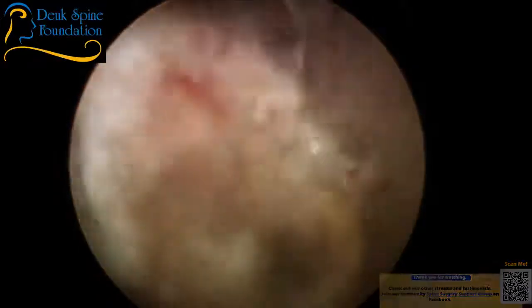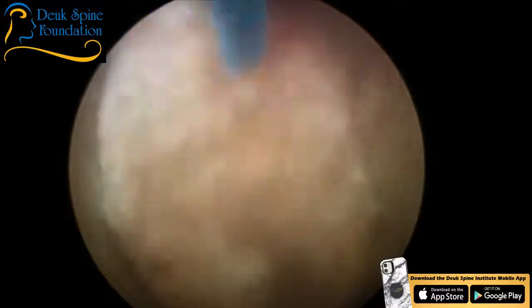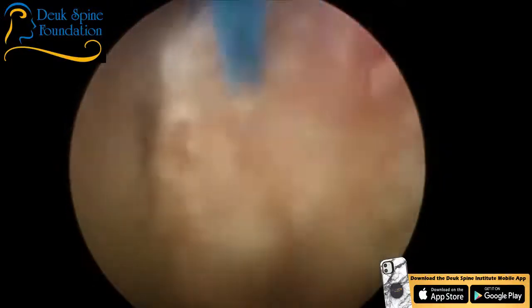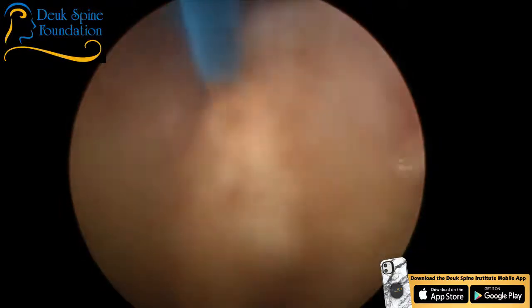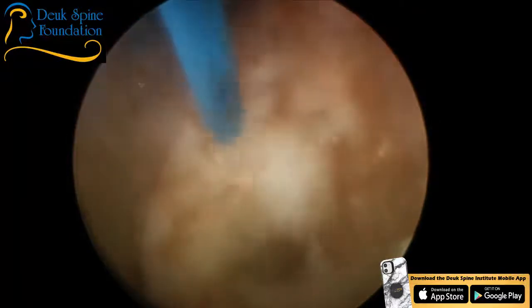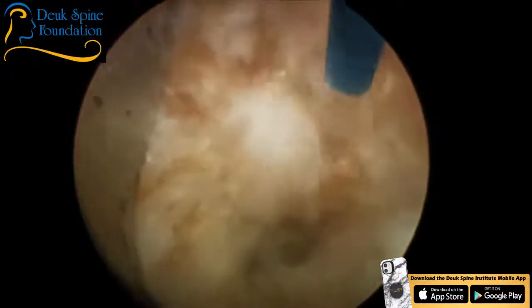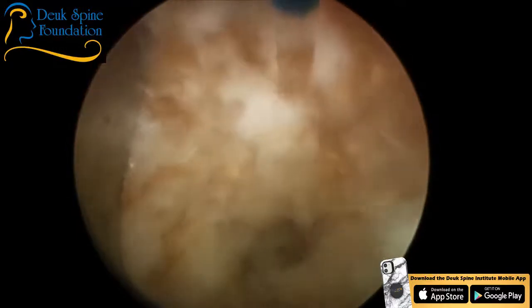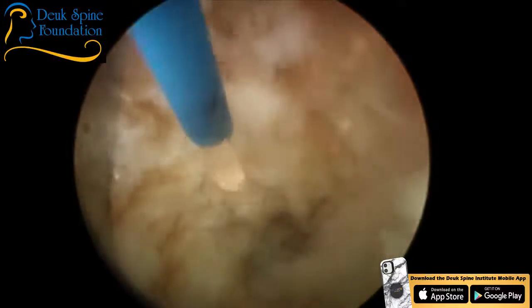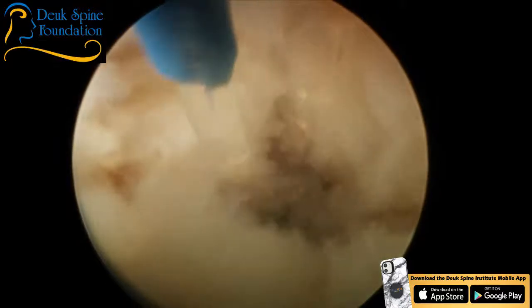All right, that's a little epidural vein bleeding. And we are just about done, probably another minute, and we're done. How's he doing? Good, good, thank you. And then we have another laser surgery coming up next. I think it's a lumbar, right, Louis? Yes, sir, 2 levels. 2-level lumbar. And that patient will be put a little more to sleep, even though this one here is completely comfortable, not responding or anything. So our anesthesiologist has done an amazing job.